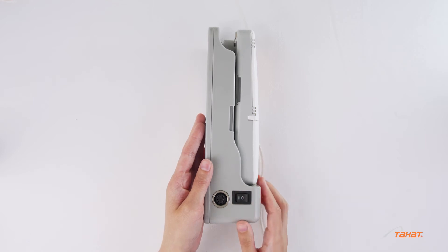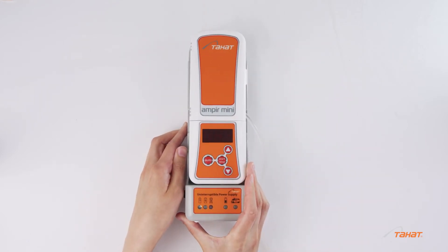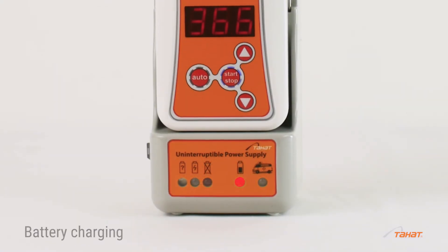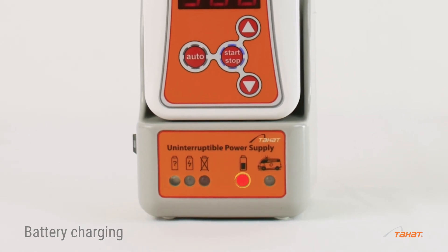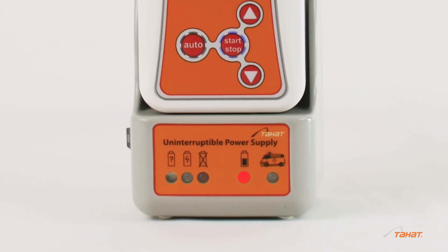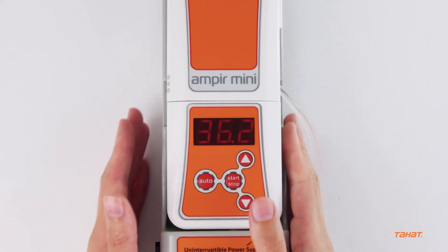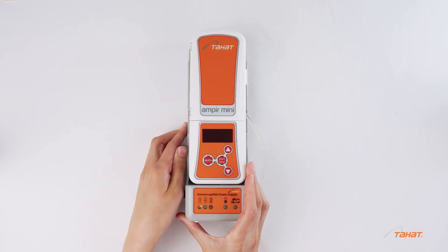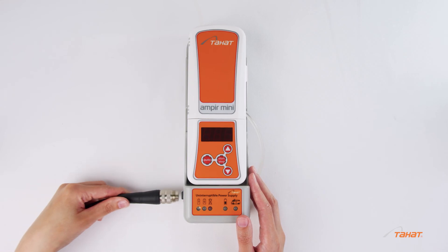If necessary, unlatch the warming device and remove it from the battery unit. In case of battery discharge, the power level indicator will turn red — charging is required. Stop the heating, switch off the device, and plug in the battery unit to the external power supply.